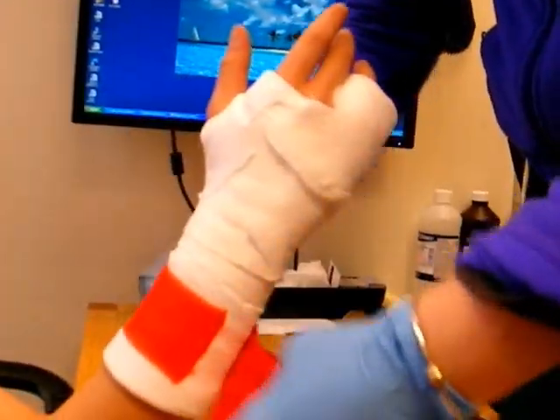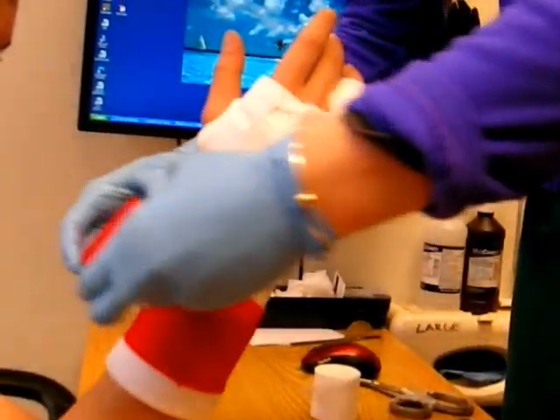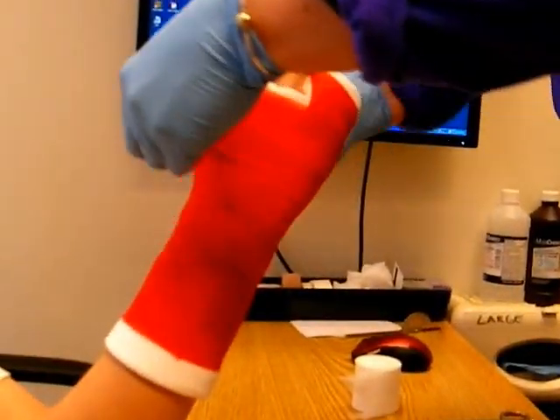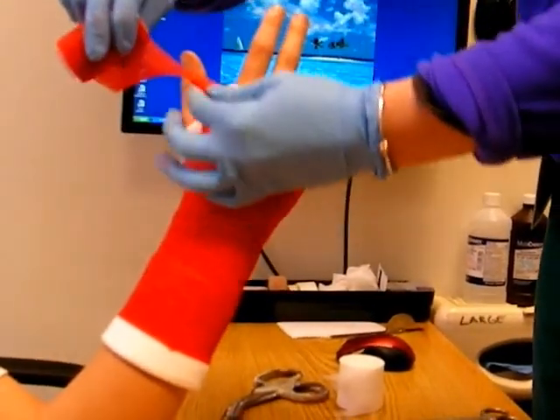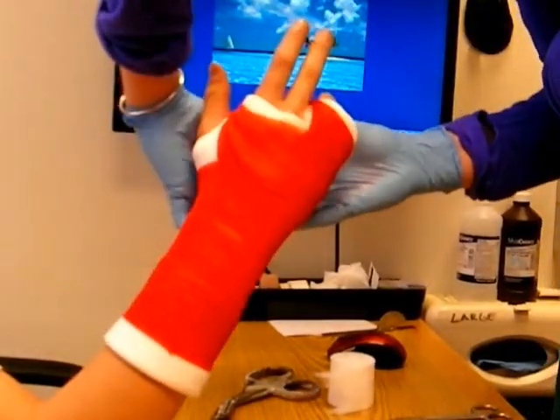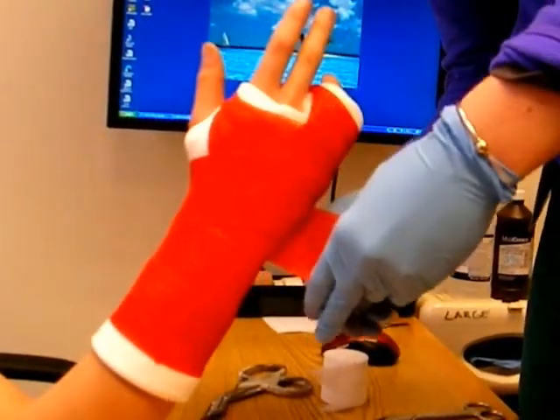The final layer of the cast is a fiberglass material — in this case the patient has chosen red, though it can be available in other colors. Fiberglass rolls on initially soft, but then goes through a chemical reaction where it polymerizes and hardens quickly within a few minutes.